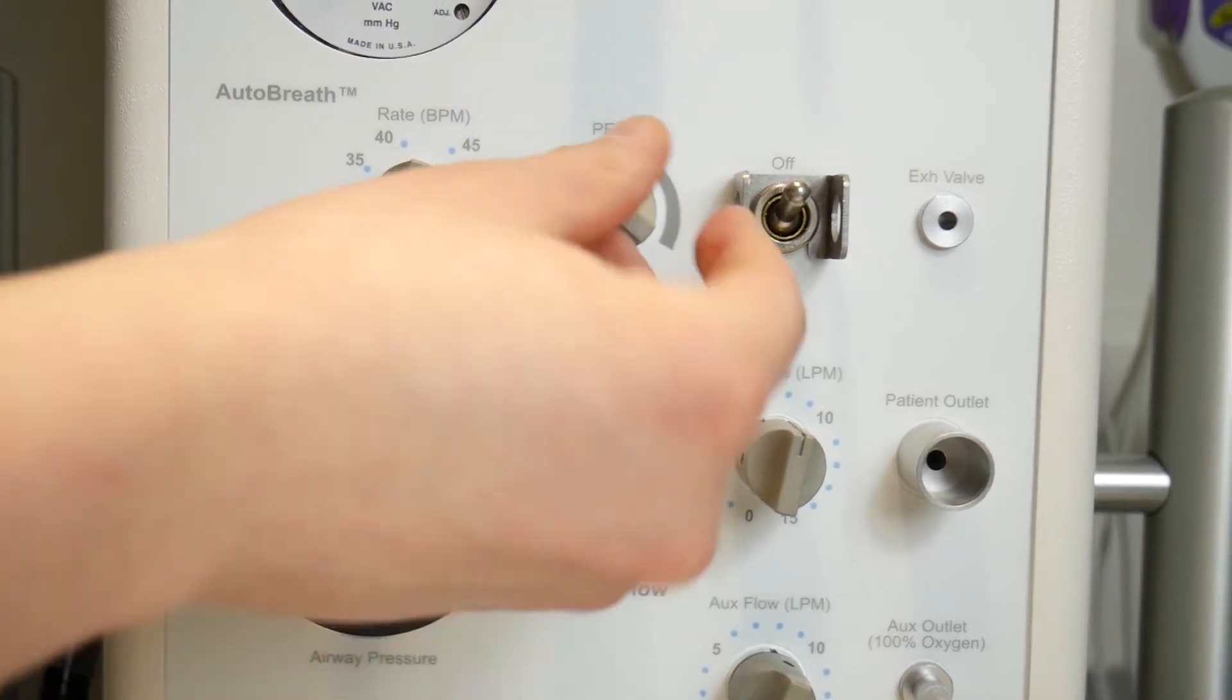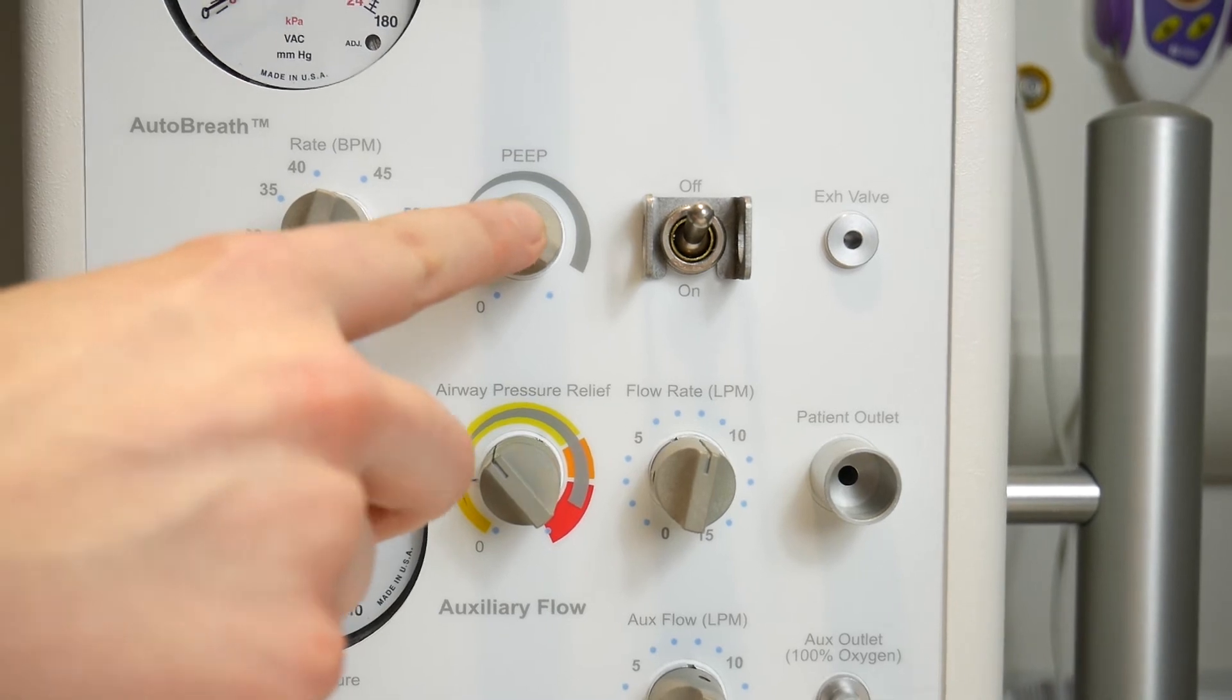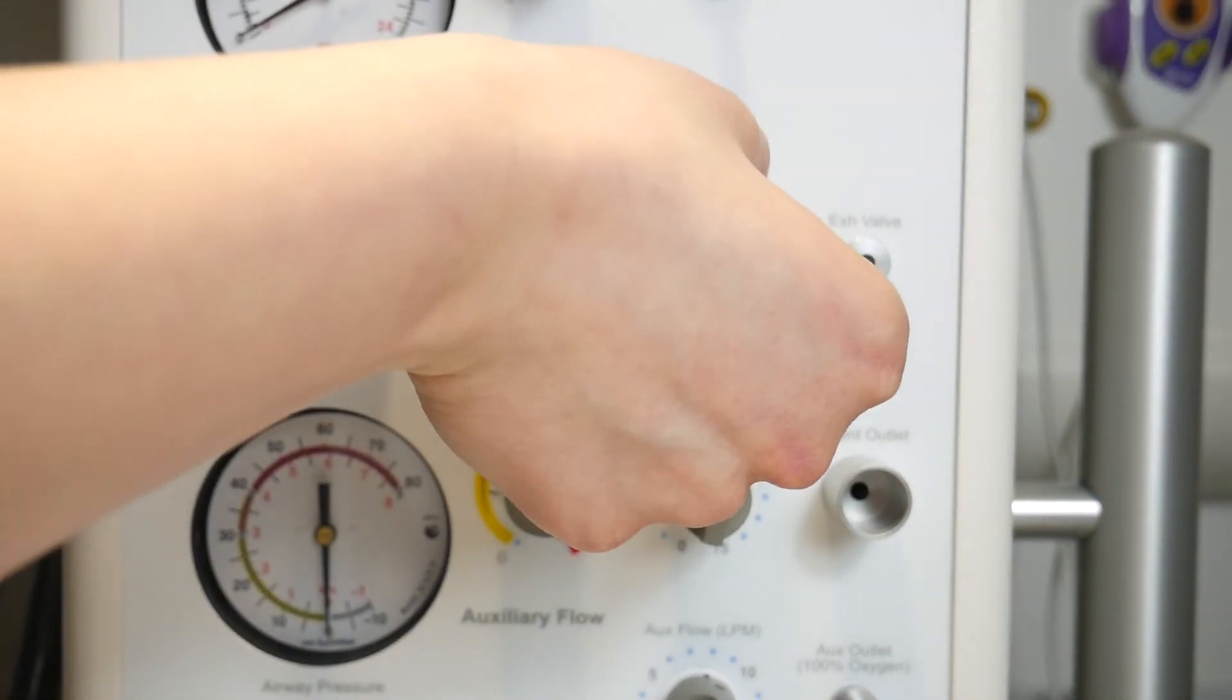If you're not setting the PEEP with the valve on top of the T-piece device, you can set it here. And to the right you have the on-off switch that you turn on whenever you're using the auto breath.